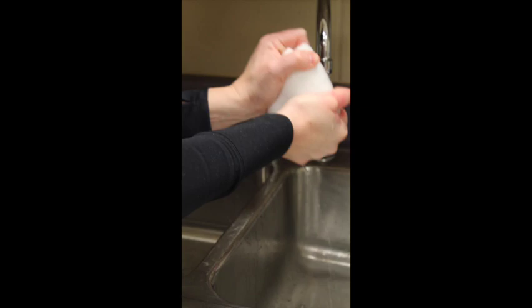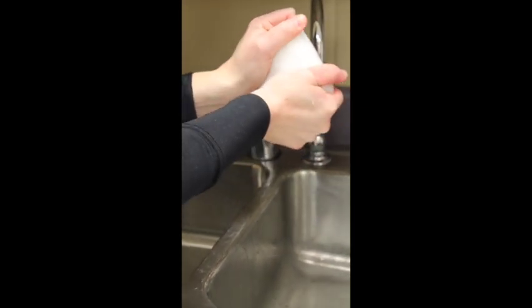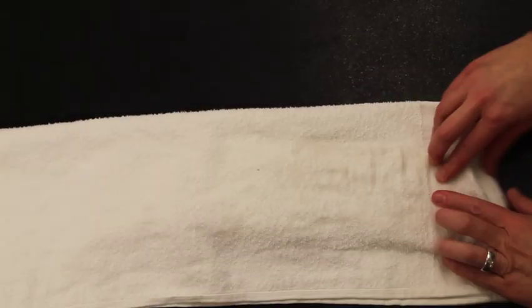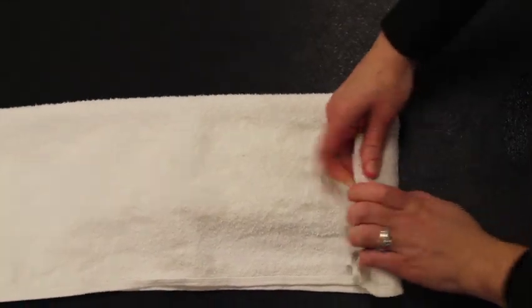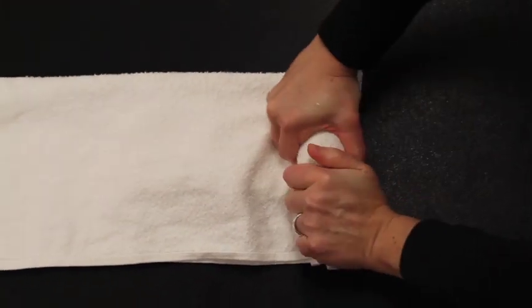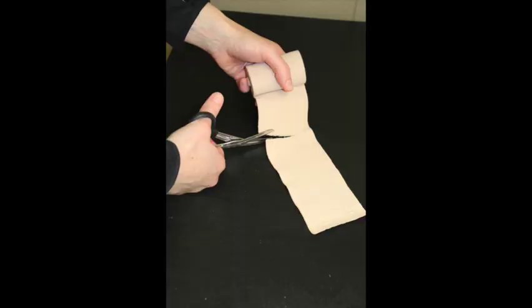Ring out as much water as possible. Place the splint in a towel, fold the towel over the splint, and ring out as much water as possible — I call this the burrito trick. Then holding the elastic bandage in my left hand, I unroll it a little and about four to five inches in I make a cut. This will go in the first web space.